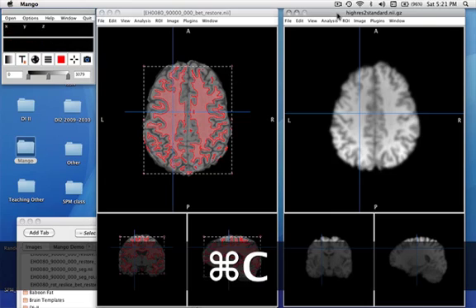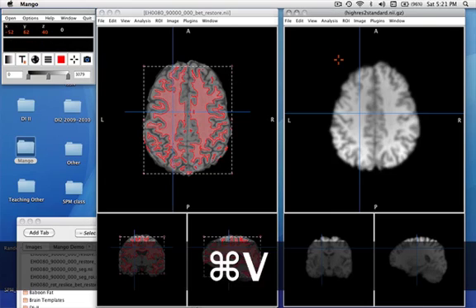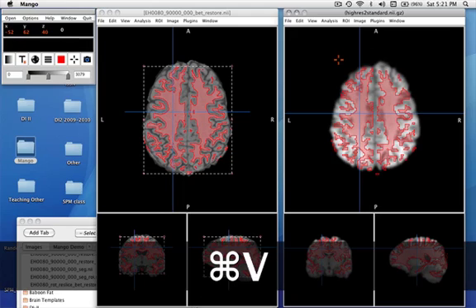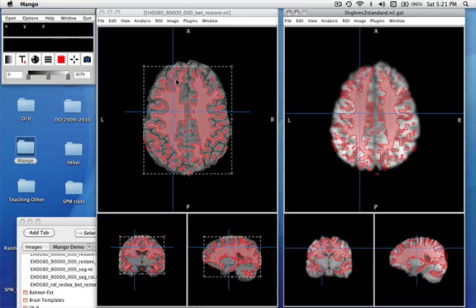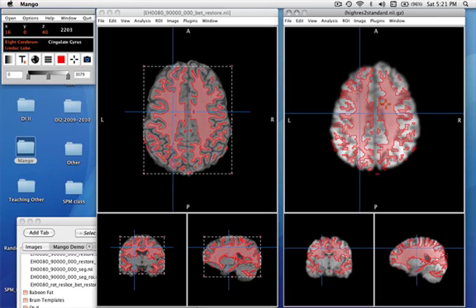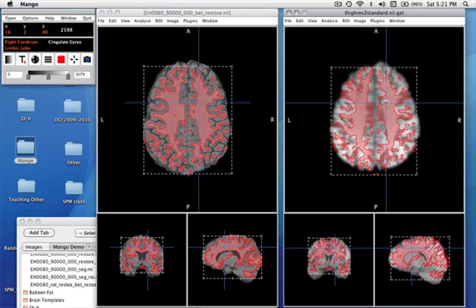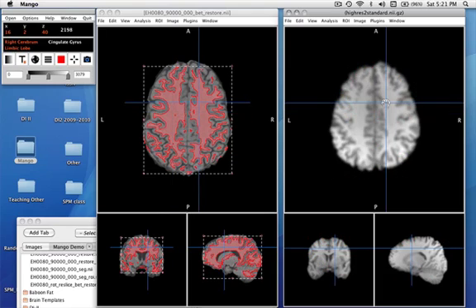And now we can paste this onto the lower resolution image. Notice that the fine detail seen in the higher resolution image is sacrificed a bit as we go to the low resolution image. Remove these regions.